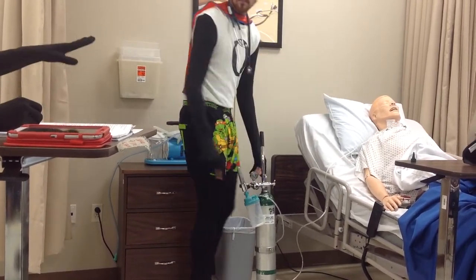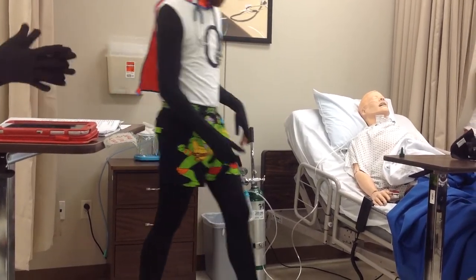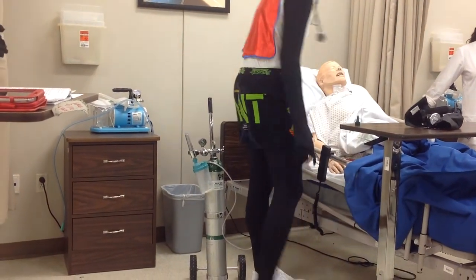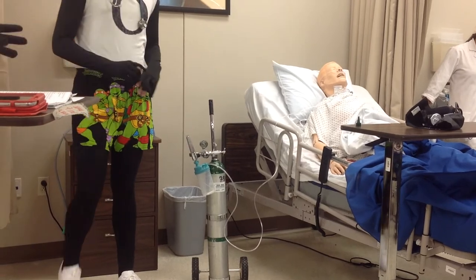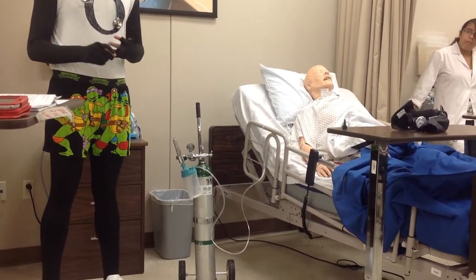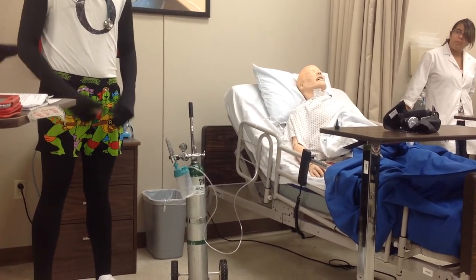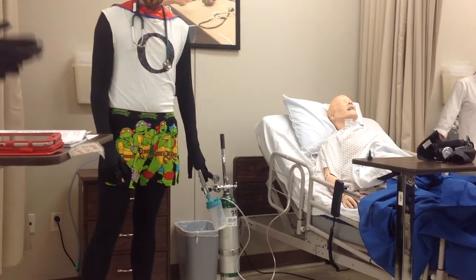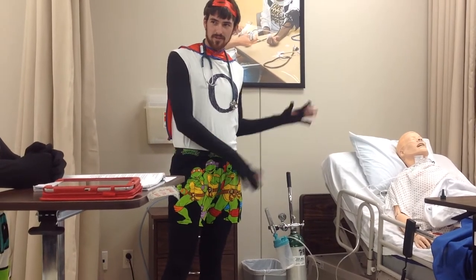So after you've done all of your assessment with your patient and applied the oxygen, you're going to wash your hands. And then you're going to leave and go document. When you document for oxygen, usually you want to document the first impression of how you saw them, if they were having trouble breathing, if they looked panicked, restless, anything like that. You also want to, of course, document your first assessment, what their baseline was, the O2 and all that. And then you also want to document the post-assessment as well.